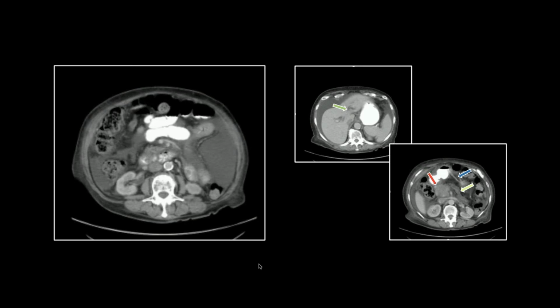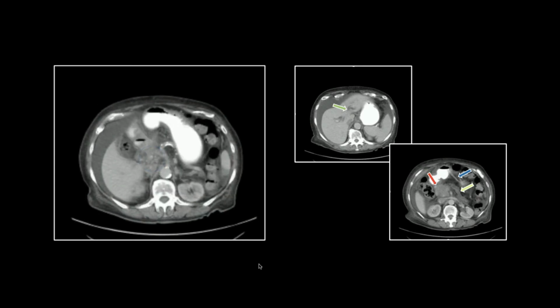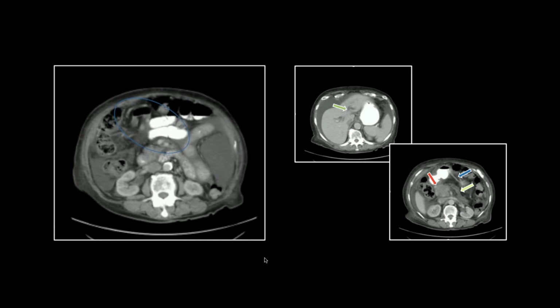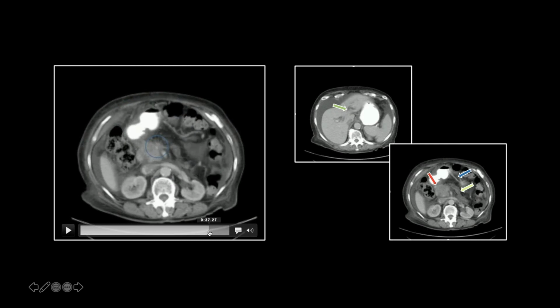The duct disappeared, right, in that intervening segment encased by the mass. And now we follow the portal vein. It just disappeared, and it will reappear as SMV on the other side of the mass. Now, you see that massive dilation, the gastroepiploic vein, right there.